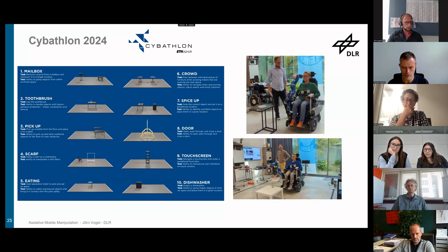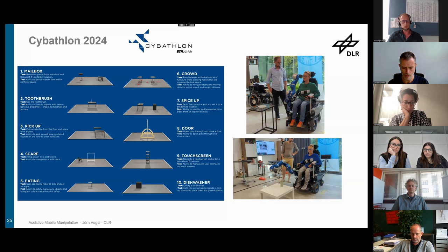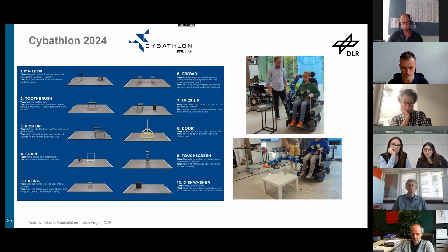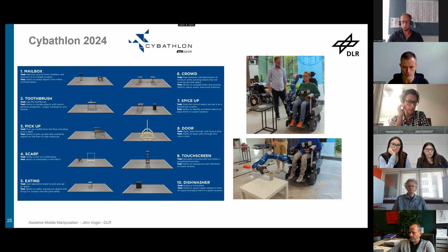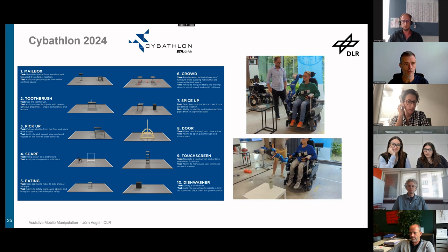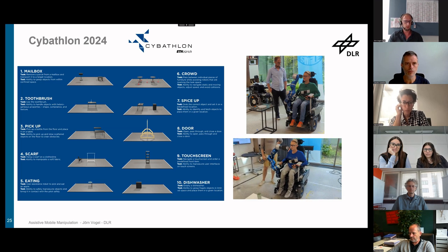And with this, I want to talk a bit about my ideas or my perspective on Cybathlon. I'm working on this topic of assistive robotics for people with motor impairments now since 2009, starting with this interface part, but then also building that system in 2016 when there was the first Cybathlon, but there was no discipline for this. So I was very happy when I saw that in the upcoming Cybathlon, there will be this assistance robot race, which exactly matches the research we are doing.